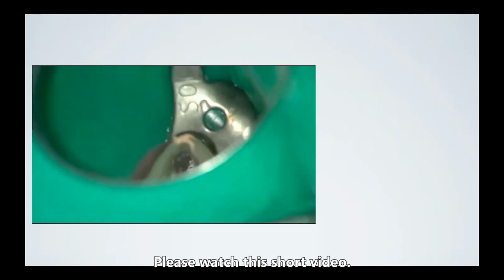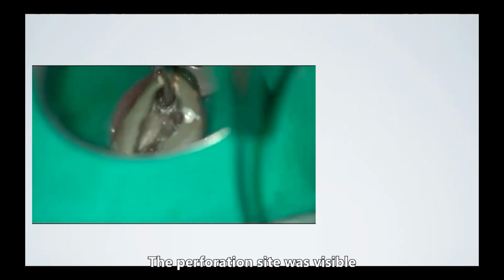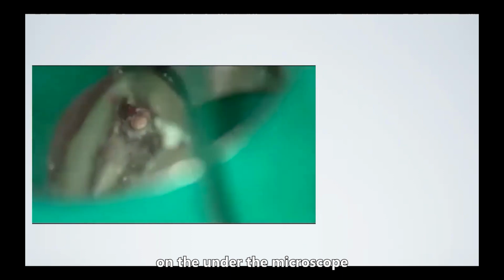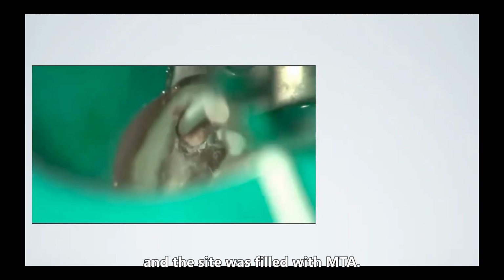Please watch this short video. The perforation site was visible under the microscope, and the site is filled with MTA.